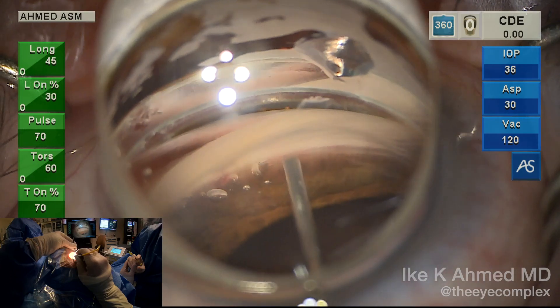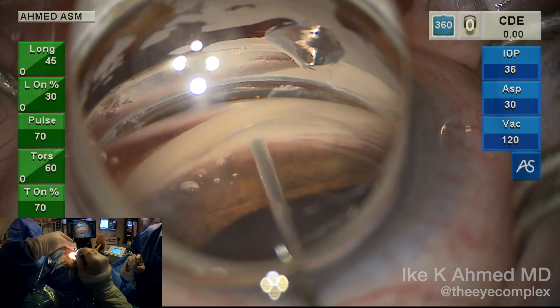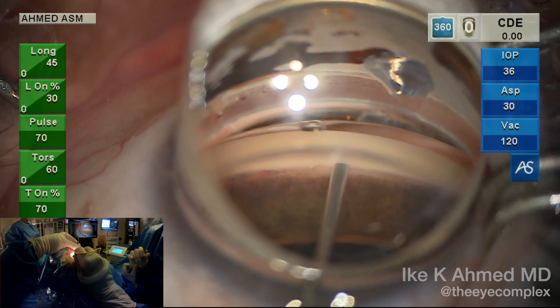You can see each shot as the foot pedal is depressed. It's a two-second duration shot, and once we have the two seconds up, we lift off the foot pedal and move to the next spot. You can see some blood reflux, which is normal to see here.